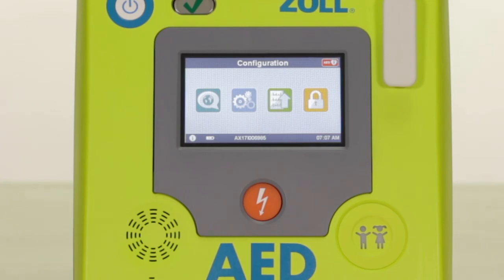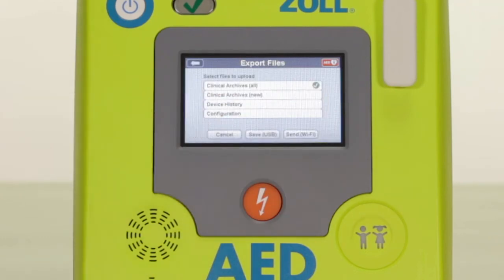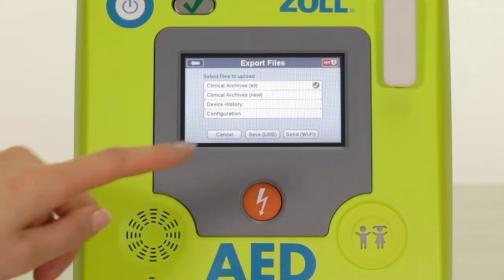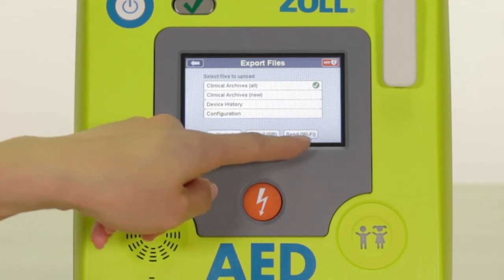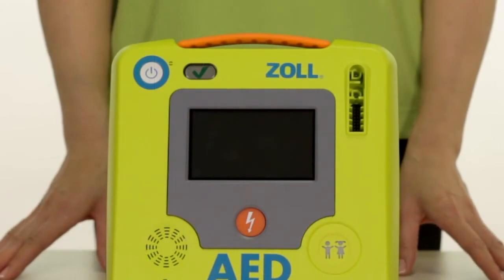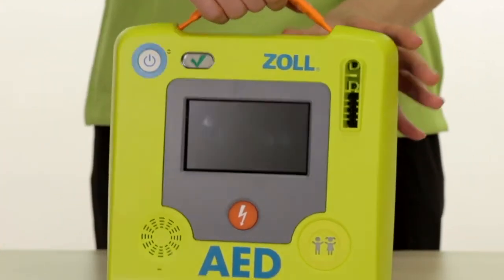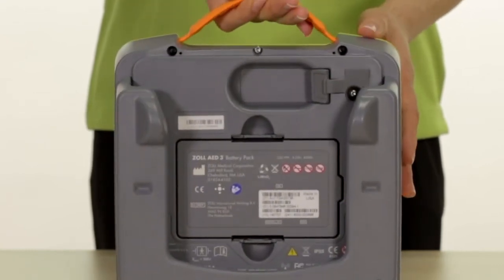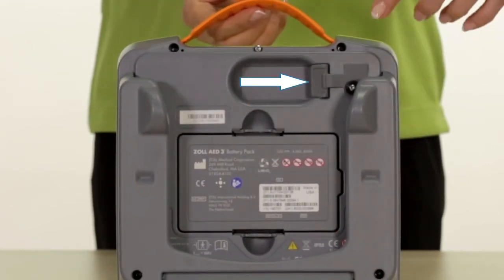The green arrow icon allows you to export event data from the Xole AED3 after a use, the device history, or configuration settings. Simply push the green icon, select the types of files you would like to export, and select either save to USB or send via Wi-Fi. If you are saving to a USB, you will need to have a USB drive inserted in your AED. The USB port can be found in the back of your AED3 on the top right under a small rubber port cover.